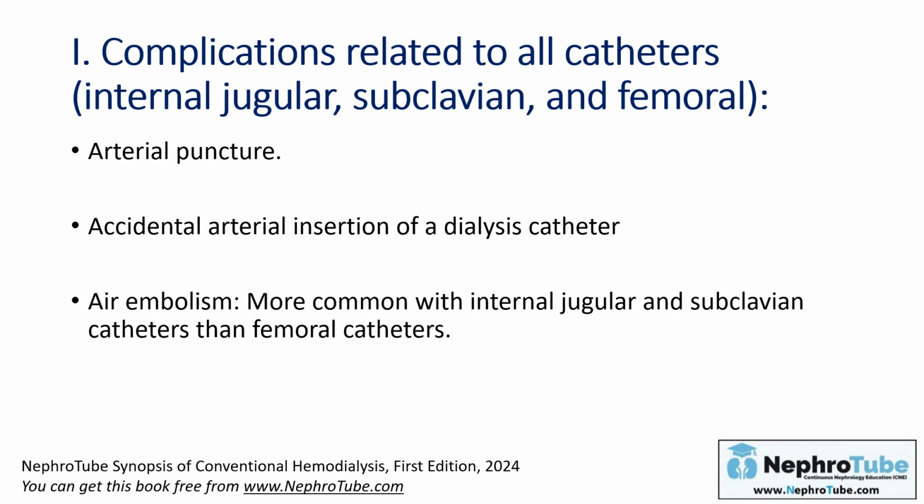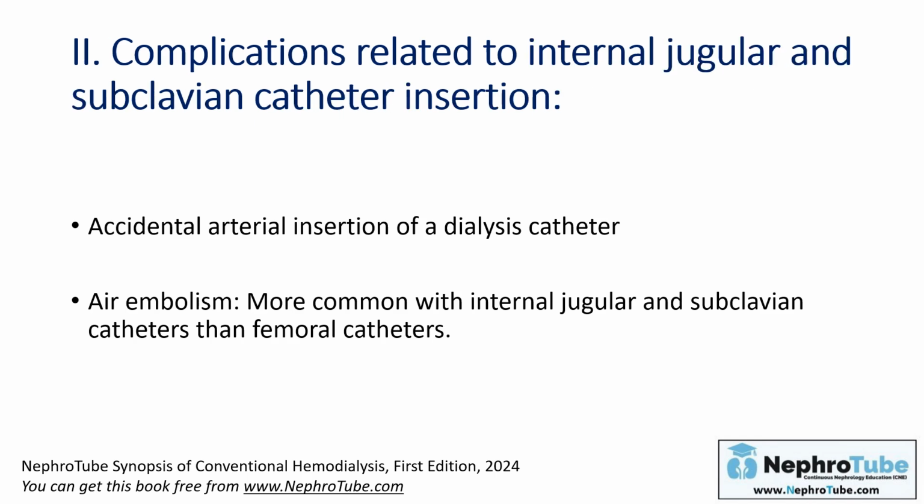Finally, air embolism can happen, but it is more common for sure with jugular and subclavian catheters than femoral catheters. So these complications are related to all types of catheters and all locations.